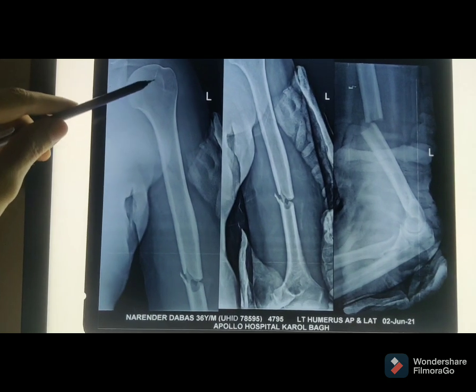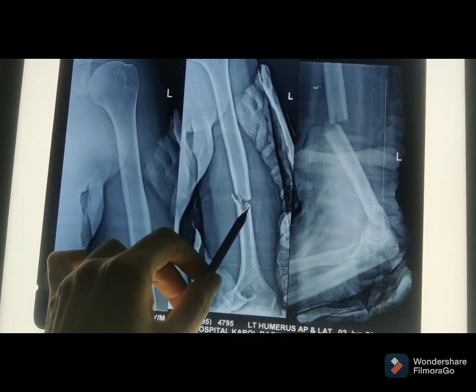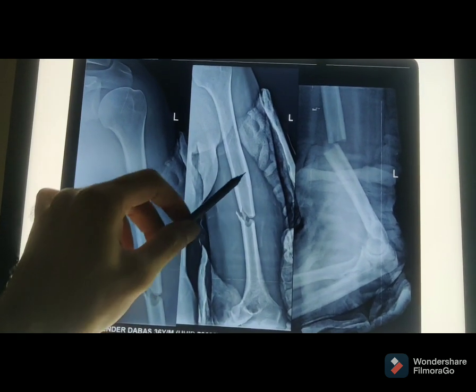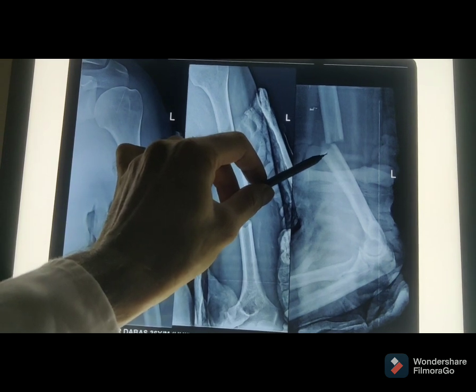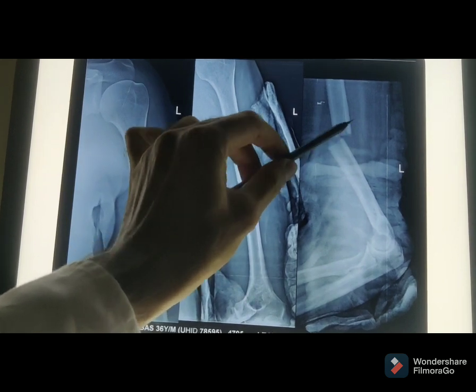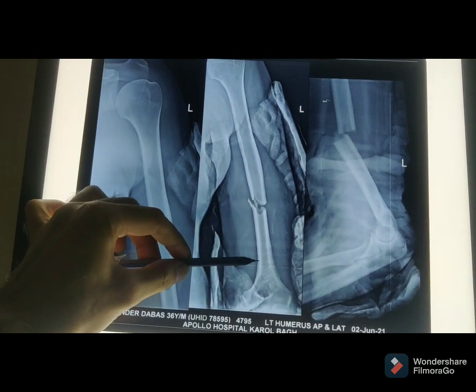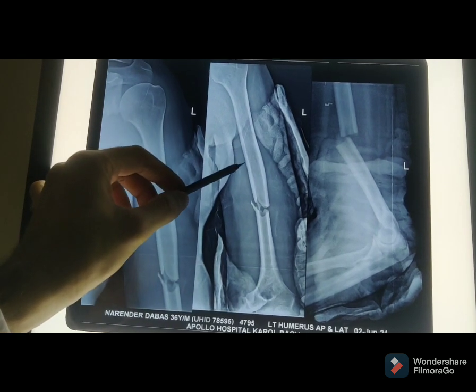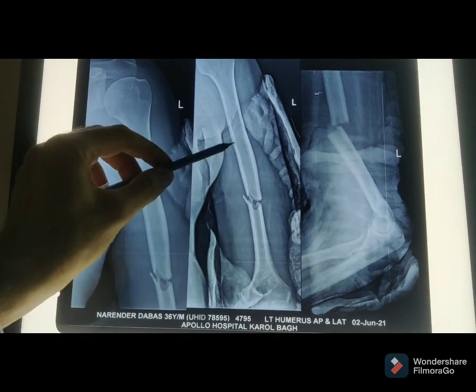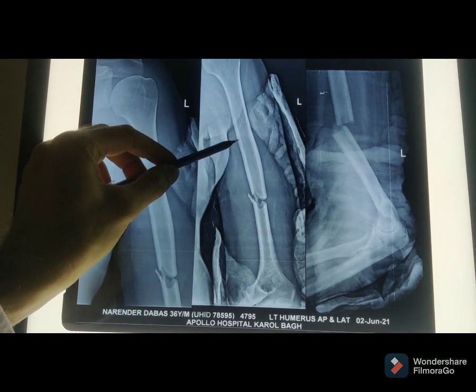This is the left arm. You can see many different fracture patterns. This is our AP view and this is the lateral view. When we look at the X-ray, you can see the fracture from the side. For this case, the treatment with plaster or plate would cause quite a bit of damage, so the best option is the MIS technique.